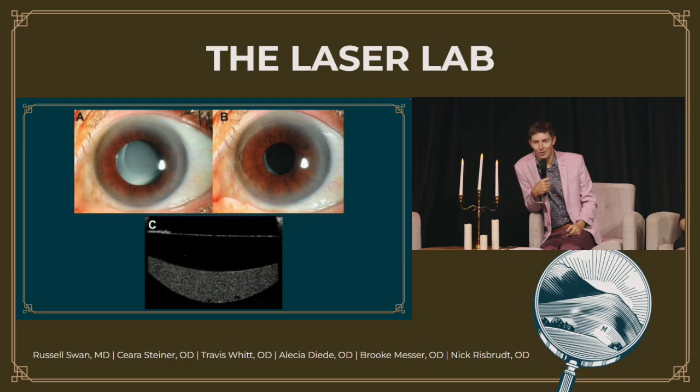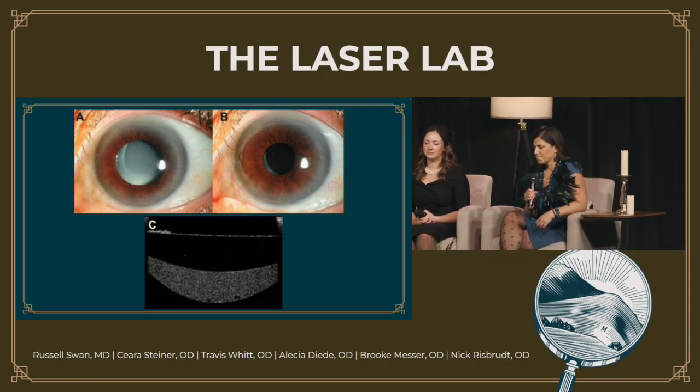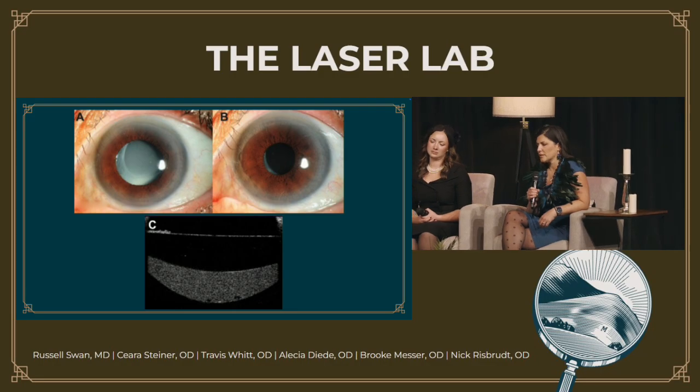Brooke, I'm going to throw this wild curveball to you and see if you've ever seen this or know what this is. That's kind of unfair, but... I've seen this twice. Oh, there you go. This is capsular distension syndrome, where fluid gets trapped behind the lens. Possible risks are excessive force or pressure used with the hydrodissection of the lens or something like that. Small association with P. acnes bacteria. So most of the time it's nothing, it's just turbid fluid and you can open it with a YAG. Low risk of endophthalmitis.